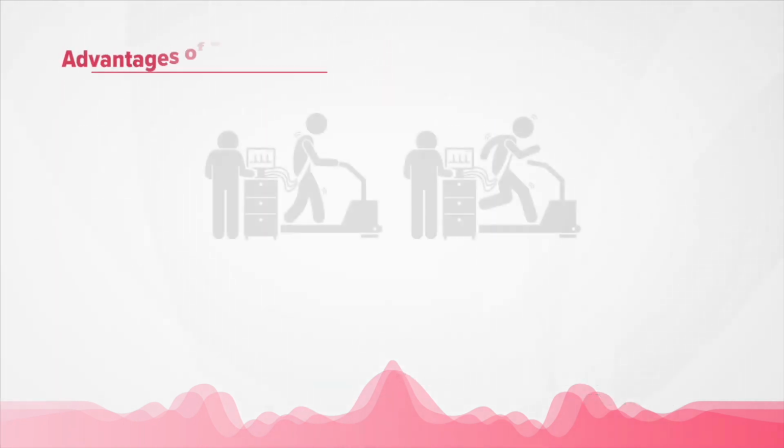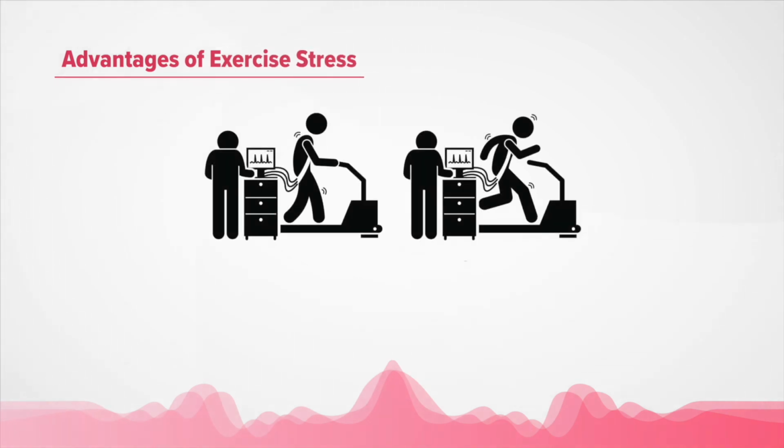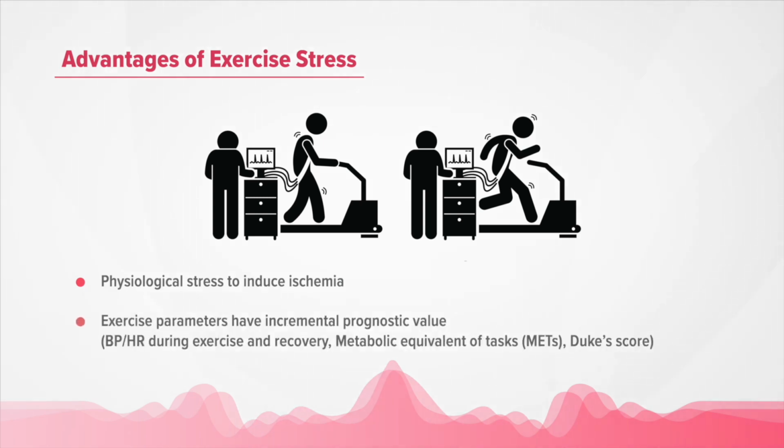There are obvious advantages of exercise stress testing. It is a physiological way to induce ischemia. Exercise parameters such as blood pressure, heart rate response during exercise, and recovery have incremental prognostic value.